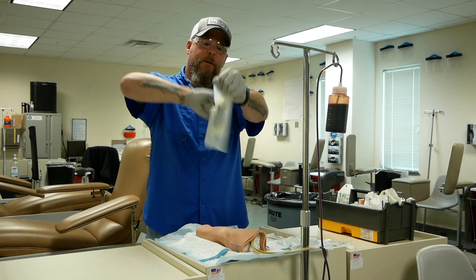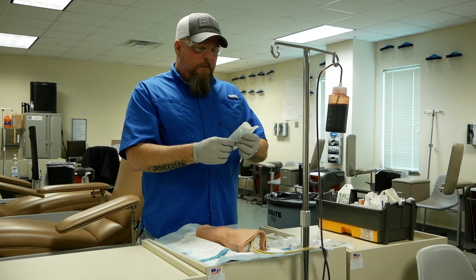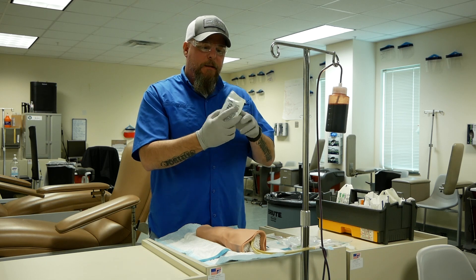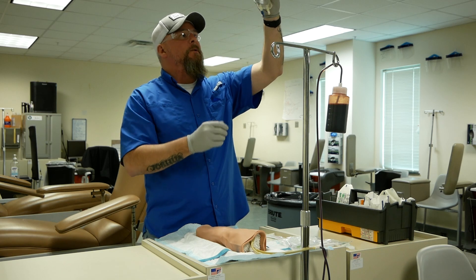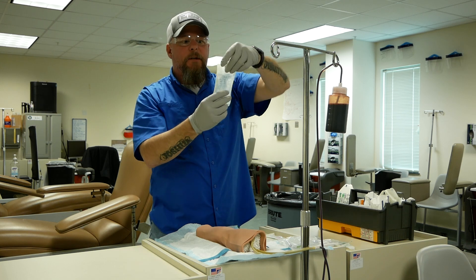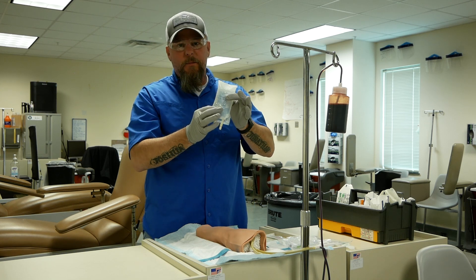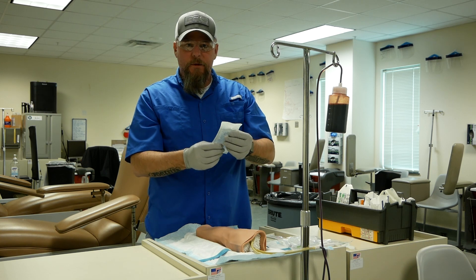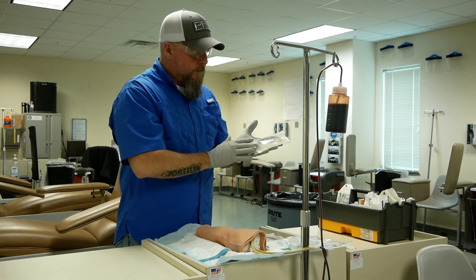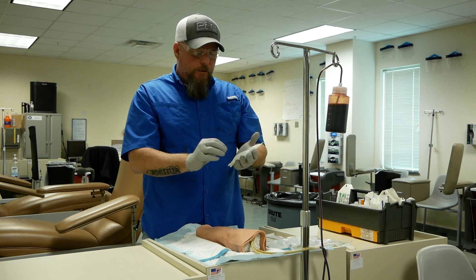There's a pull tab right here and you're going to pull this towards your body. Inspect the expiration date in the upper right-hand corner — this one as an example is March 2020. Next, hold it up in the air and give it a little squeeze to ensure there's no leaks, then hold it to the light and inspect for clarity and particles. Your instructor will tell you that you have a good bag, which will prompt you to do your second check. Your second check is again triple DPRT, and this time you want to also verify your provider's orders one last time. Once your second check is completed, flip your bag to where there's no writing and label your bag with pen and your initials, the co-signer's initials, the date, and time.